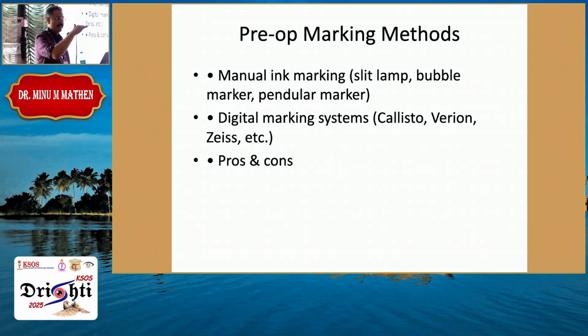You can get the best alignment, best positioning of the head and all those things. Because that is the one which will lead you. After that, there is nothing. Unless you have Verion or Callisto or whatever. How many people have Verion?